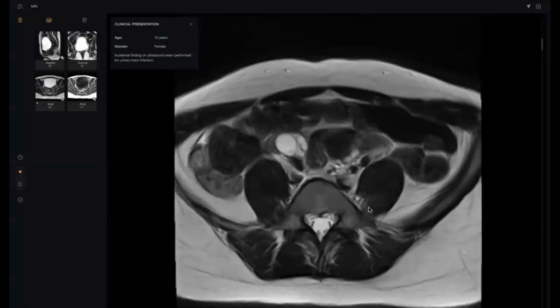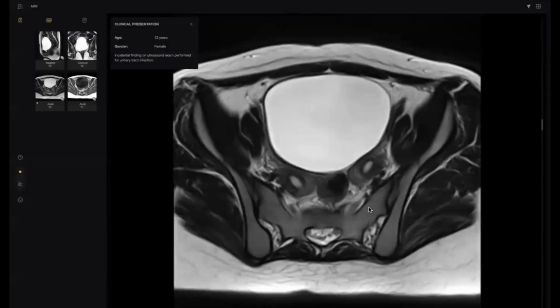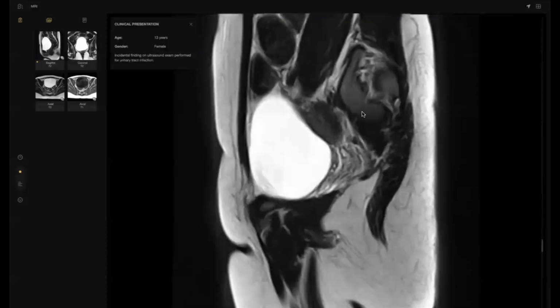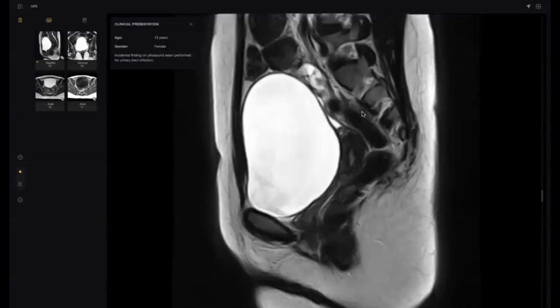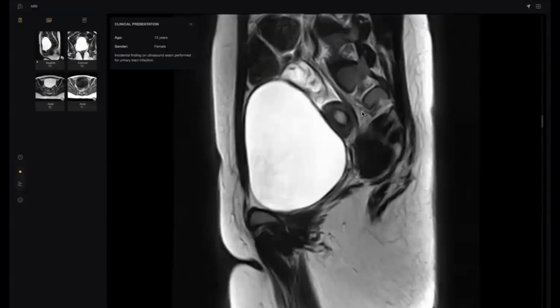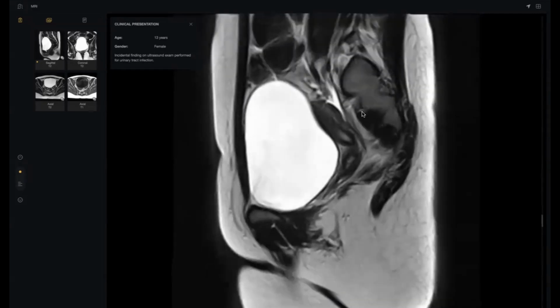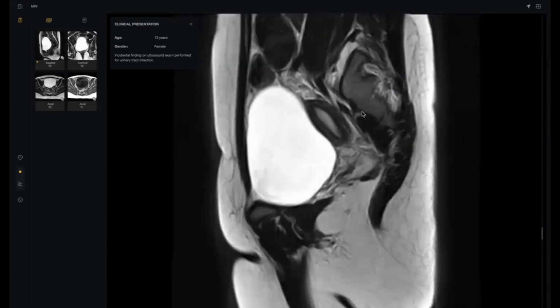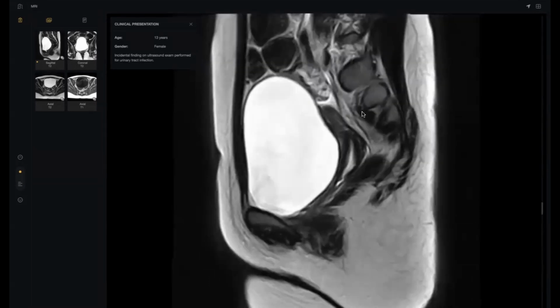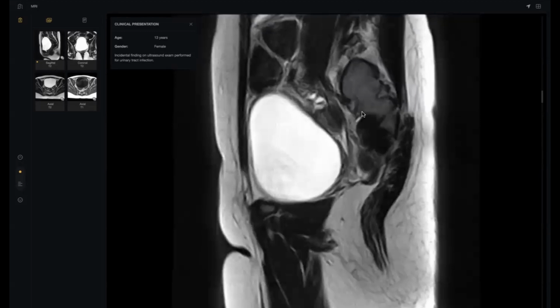Almost ultrasound. This is a case of didelphys, and you can pick it up from the sagittal. It is difficult, yes, but if the examiner wants to, yes, ultrasound. From the sagittal, see, one horn is smaller than the other horn. See here, this is the uterus. Then it becomes very small. Then what is this? See, one horn, then cervix, and another cervix, then the second horn.